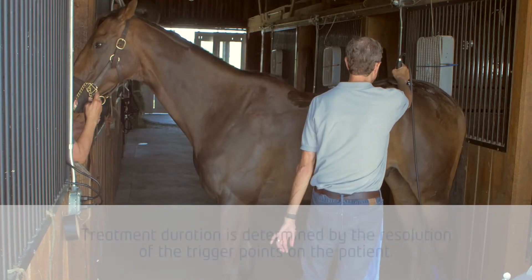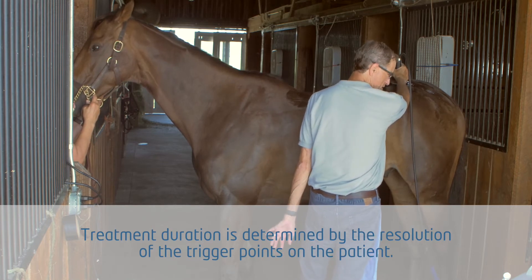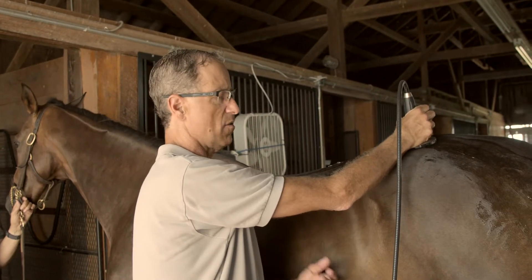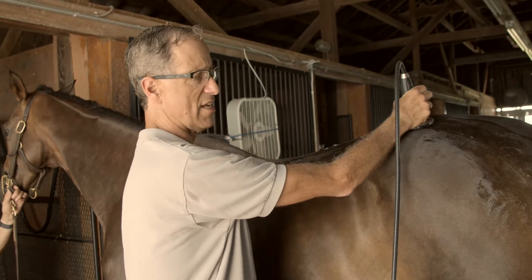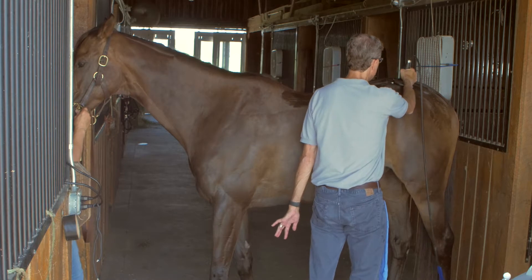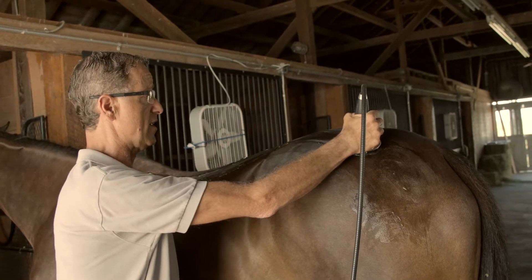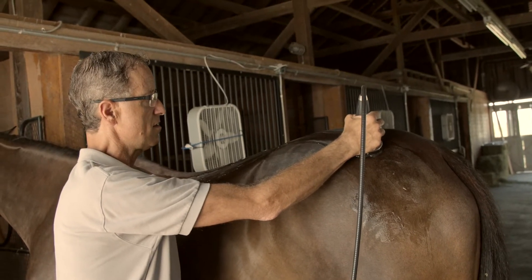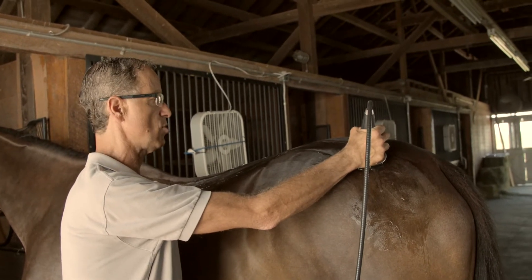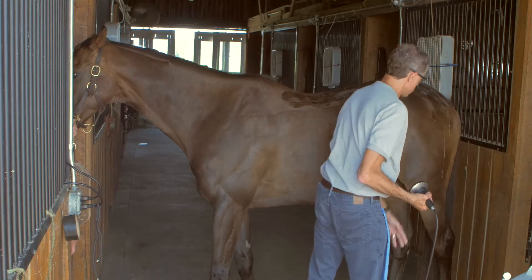To quiet this down thoroughly, you'd probably want to put in around 500 clicks just in these areas. You don't have to worry about whether you're doing 6,000 shocks, 2,000 shocks, or 10,000 shocks — it's going to cost you as a practitioner the same amount. This has immediate and reliable results, and the fact that he's not tranquilized allows me to be super precise about where I'm applying the energy source. If you follow these paths, you can't miss.